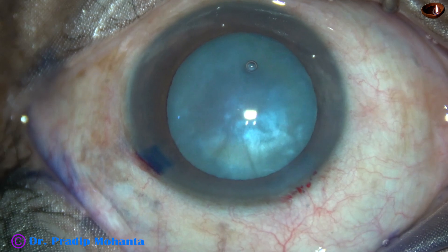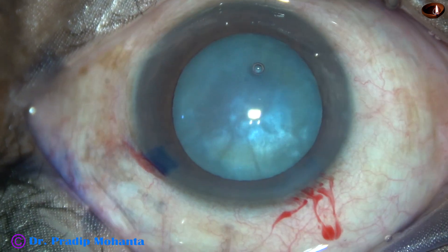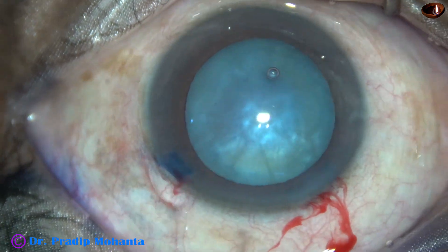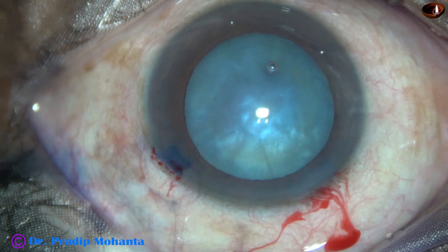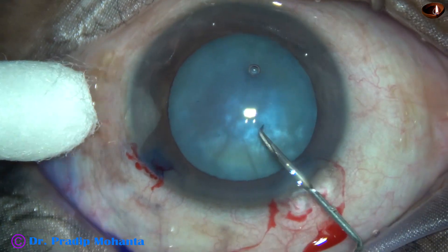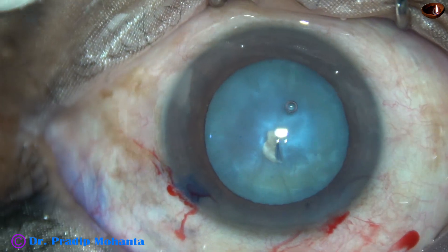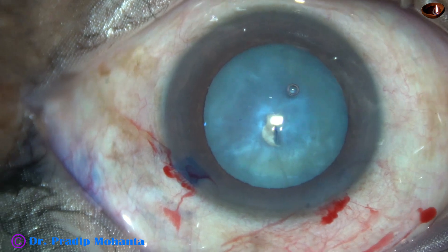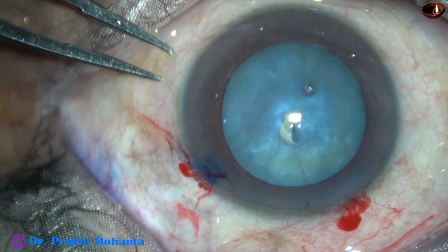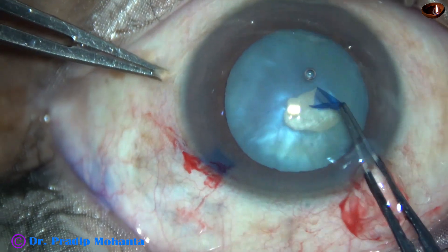A 26-gauge bent needle is taken and the capsule is incised at the central part. The C-flap is made. I find that there is no egress of any fluid from the lens — so this is not an intumescent cataract.